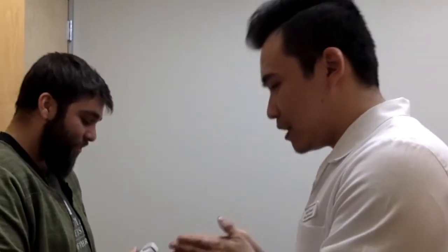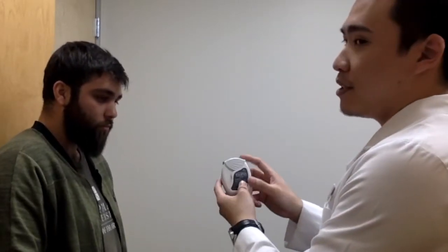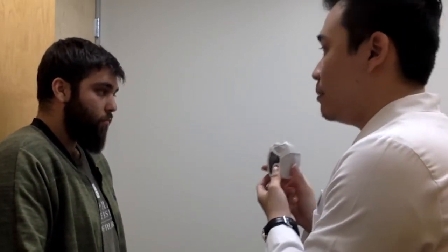Thanks for showing me how to use the inhaler. I think we found the reason why it's not working for you. That's one of the common mistakes that people make when they use the inhaler. I'll demonstrate the proper inhalation technique for you. First, you slide down until you hear a click. If the counter does not count down until you hear the click, the inhaler will not deliver the medicine.